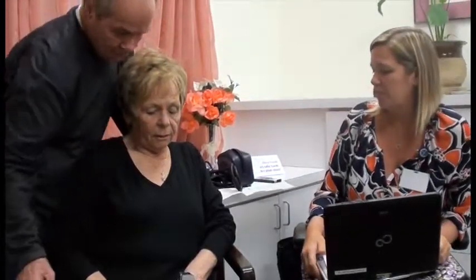Now look at this. Your oxygenation went up to 94 from 92. It did go up. That's awesome. So that just proves your inhaler's working for you right now.